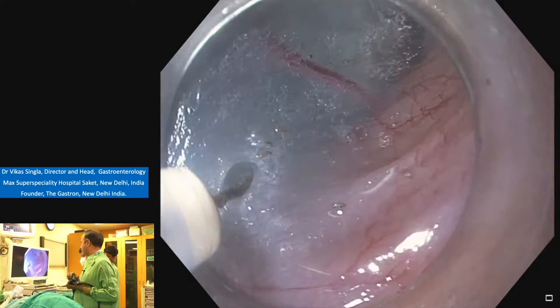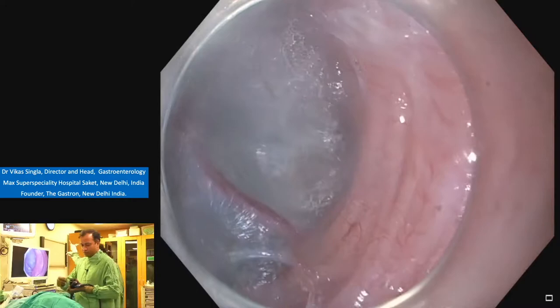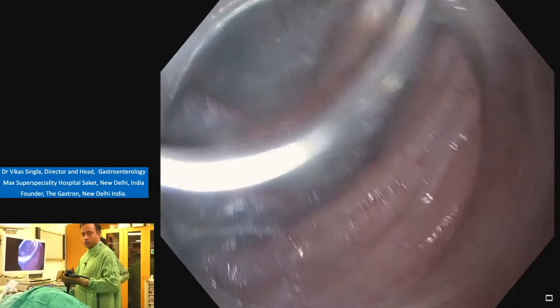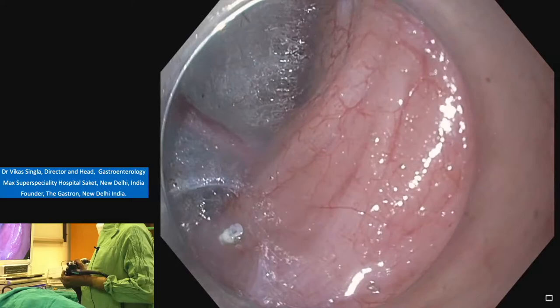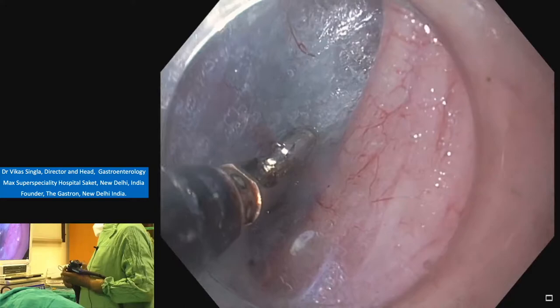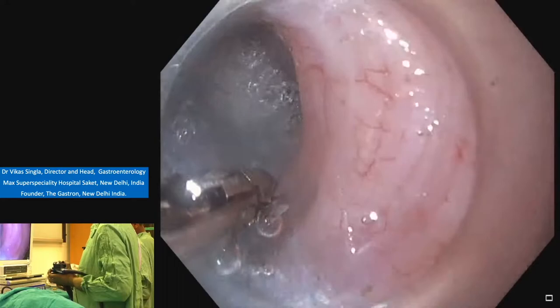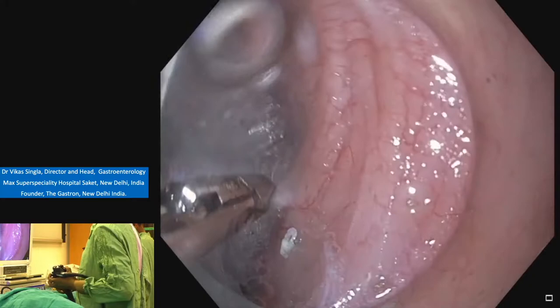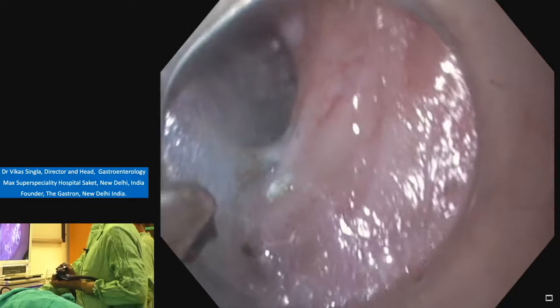Now you can see there is a large vessel. So we'll use the other accessory, which is the coagrasper. Zoom on this part. So this large vessel has to be grabbed with the coagrasper. Open. So once you grab it, we'll use the soft coagulation, and setting is voltage 60 and effect 3. Open. We can see that it has become totally white. Then we cut the vessel.